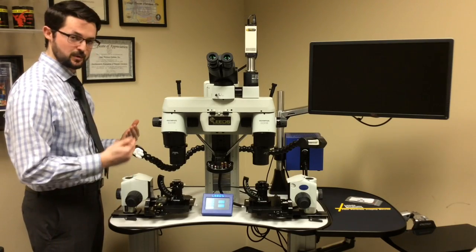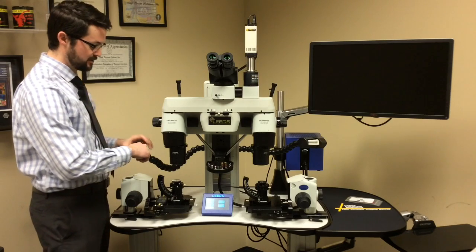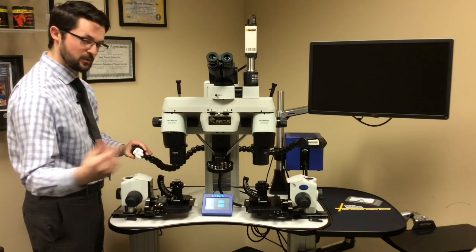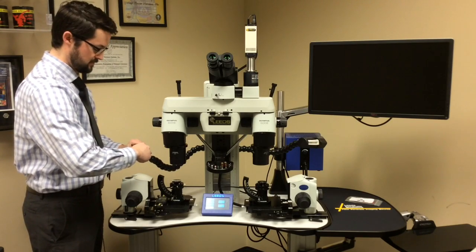The next step is to remove the light bulb itself. This is why I have it turned off. I'll just grab it and then gently pull the bulb straight out. You can wiggle the bulb to work it out and that's very okay.